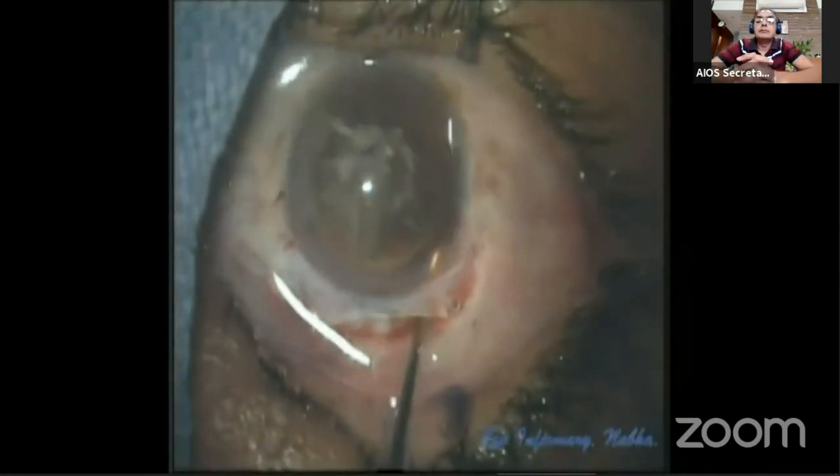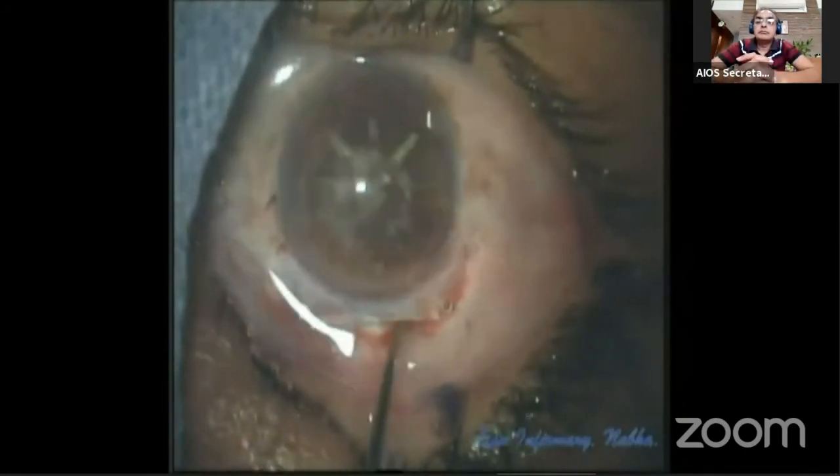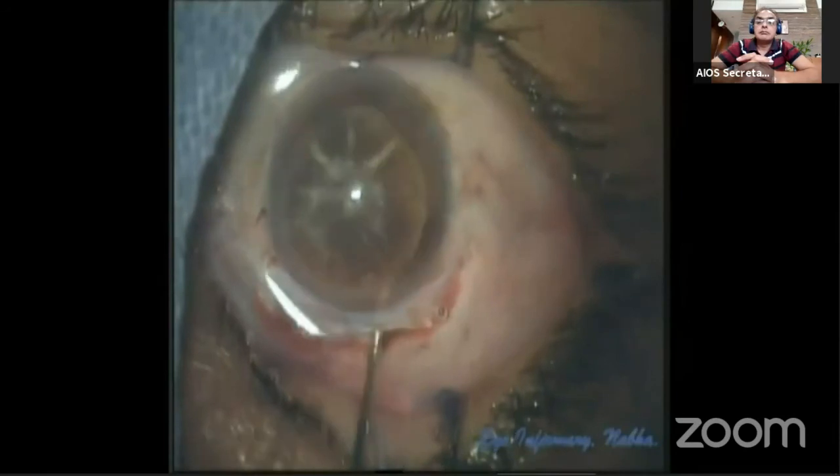The hydro cannula is then exchanged with the visco cannula to inject visco all around the nucleus and to build up visco pressure in the AC.